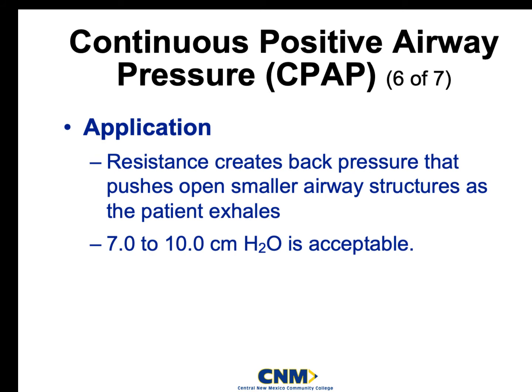When you move up in level of licensure, you will be able to play with a little bit more PEEP. The problem with inducing more PEEP in our patients is that it can get them extremely dehydrated. So the reason why we stop you at 10, which is about the average, right? Most of the time, even myself as a paramedic, I'm not going past 10.